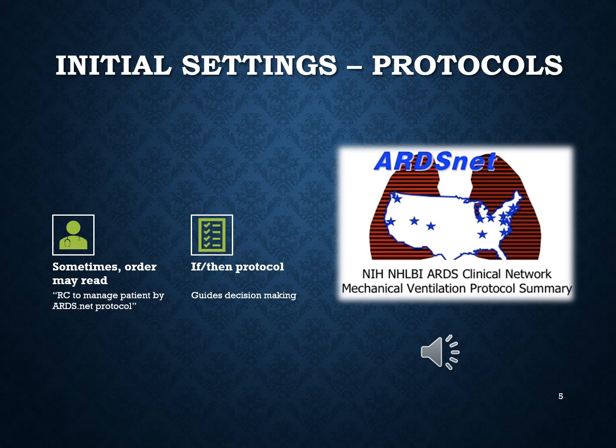So it also helps guide your decision making. Although I know you are a great therapist, you're all going to be wonderful, it does help guide that decision making just to make sure that, okay, this is what I think we're going to do, but let's double check by visiting this website. And also, the main thing here is you have that window to adjust your settings without having to call your physician.